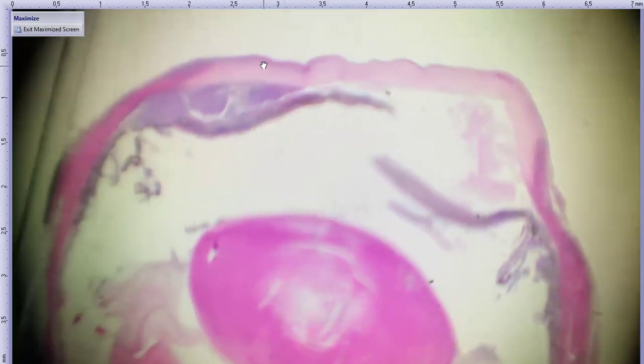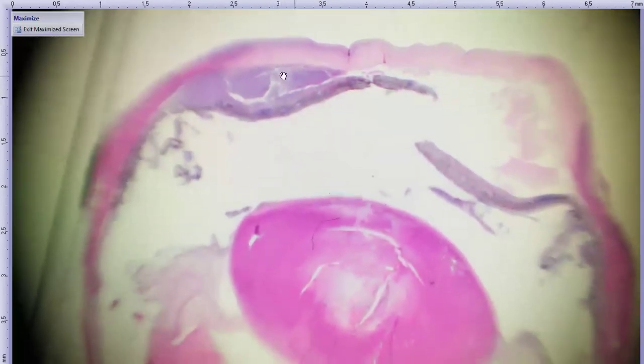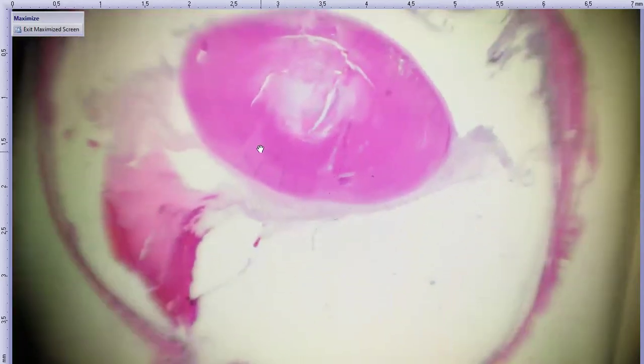So like in the gross picture, I got the cornea up here at the top. We can see that what was once a white tan color grossly is now very purple here, and it's in the base of the iris over here. And we got a little bit lining the ciliary body over here. Here's our lens. So we can start to see a little bit of liquefaction of the lens fibers, so some cataractous change, and some eosinophilic material and hemorrhage in the vitreous, and cupping, pretty big cup in our optic nerve as well.